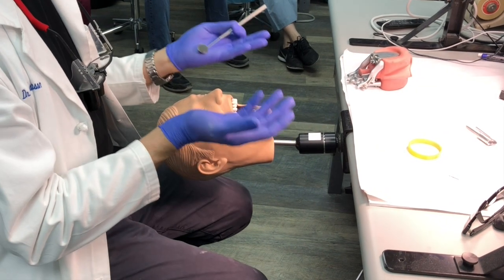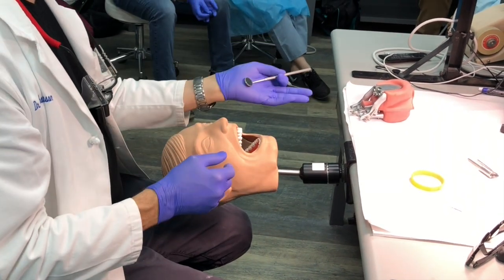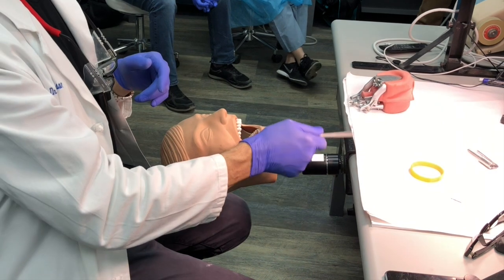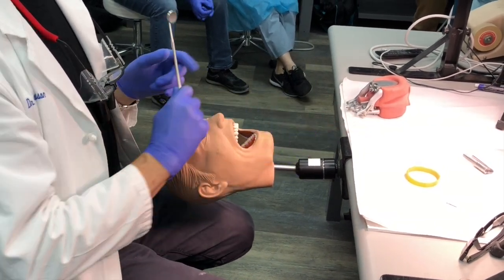Left-handed operators: it's exactly the same, you just change the numbers. Instead of seven you're at five, instead of nine you're at three, instead of eleven you're at one. Neither left-handed nor right-handed operators get to work at six o'clock — six o'clock is for home use only.